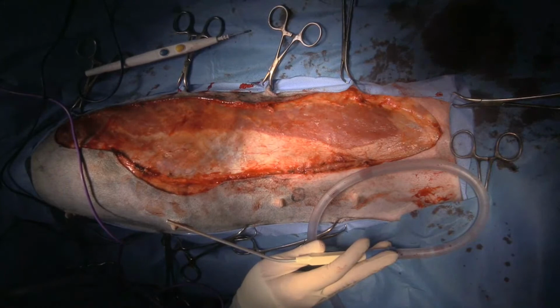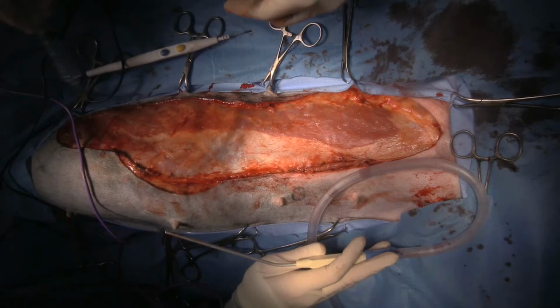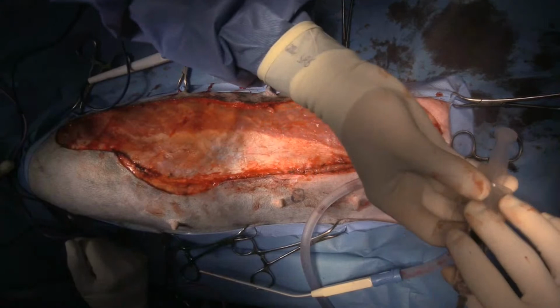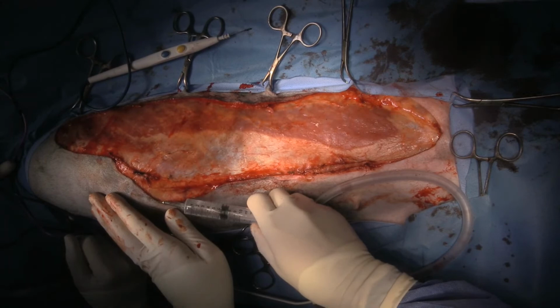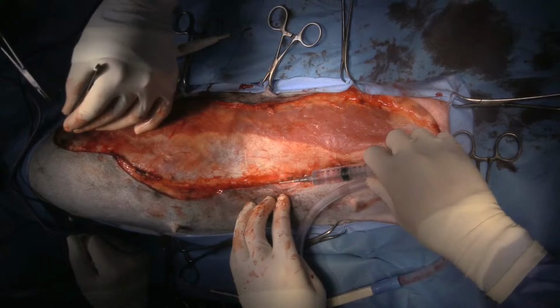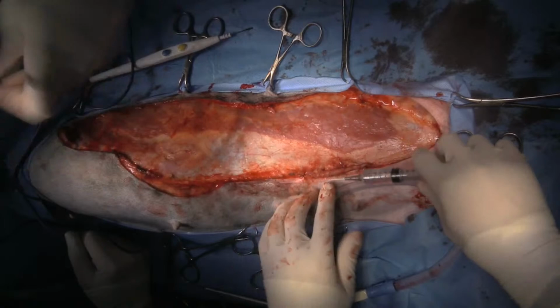So I'm diluting my mepivacaine. I'm squirting it on topically. And you want to go around and then just inject within the body of the skin. So I'm going to close in two layers. I'm going to try to get the cutaneous trunci to try to reduce the amount of tension that we're putting on the skin surface.